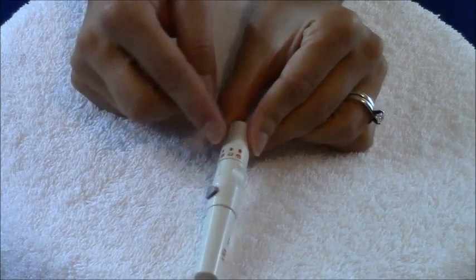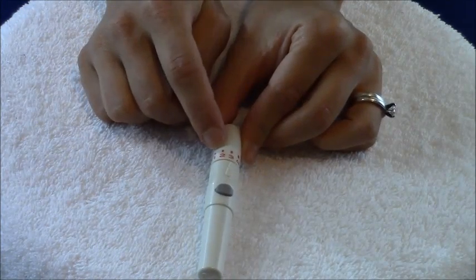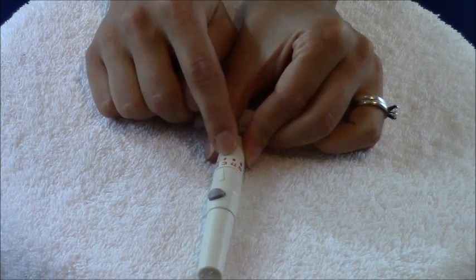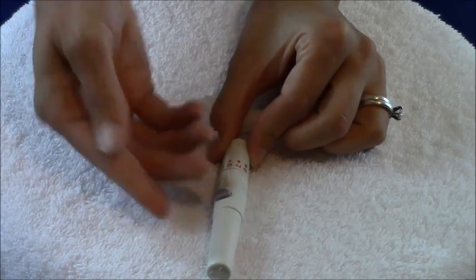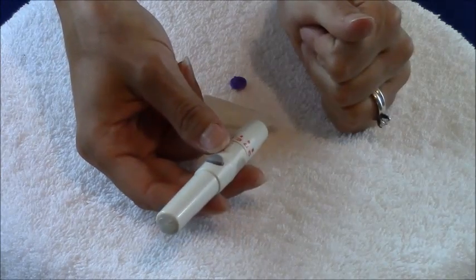Now pick the setting for how deep you want the needle to poke your finger. Settings one to two are best for people with really thin skin. Three to four usually works best for most people on average, and five or higher is for people with really thick callused skin. I'm going to do a three.